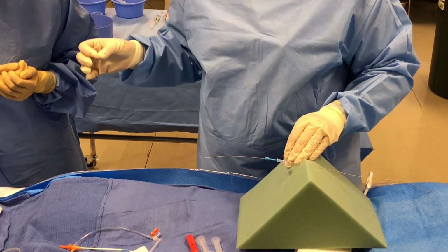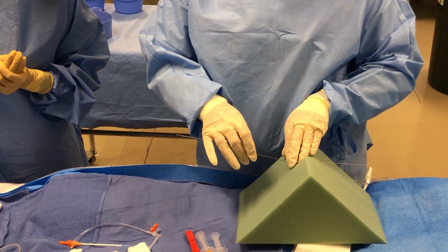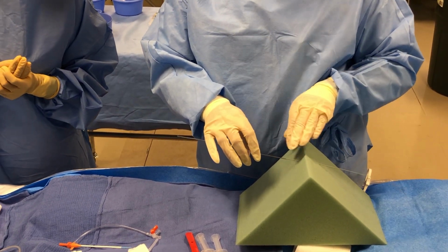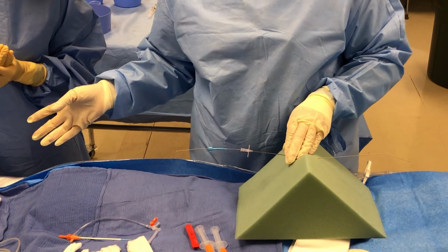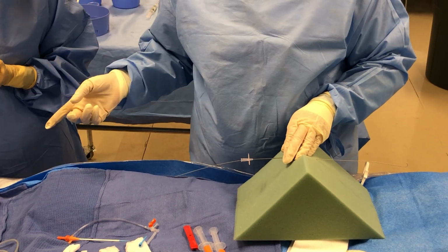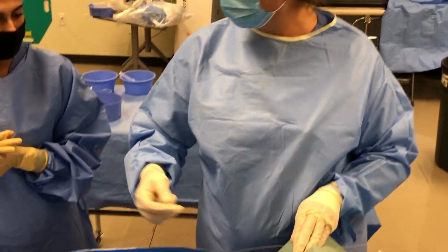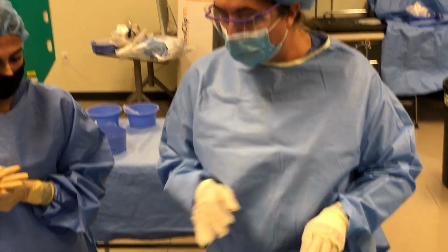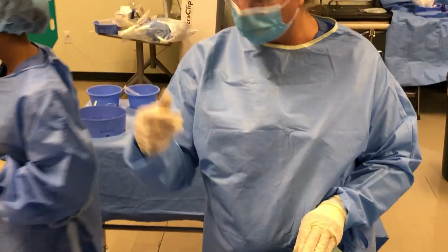The next step, we have to remove the needle. We got to keep the wire in place though. So the doctor, if it's a short wire, this is when they're not really going to need your help, okay? If it's a long wire, they're going to need your help, and we'll demonstrate that in a minute. So the doctor would just take this needle off, throw it down. You would get that, turn away from me, and go stick it in the sharps box.